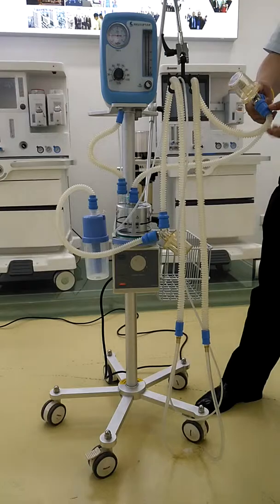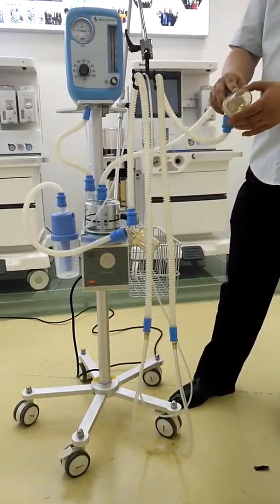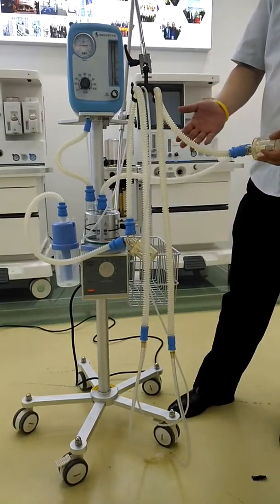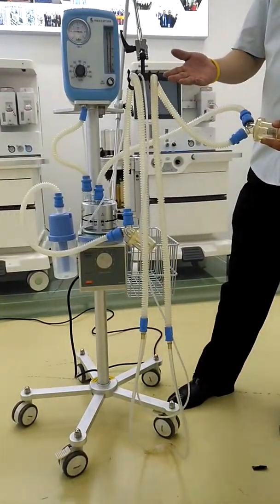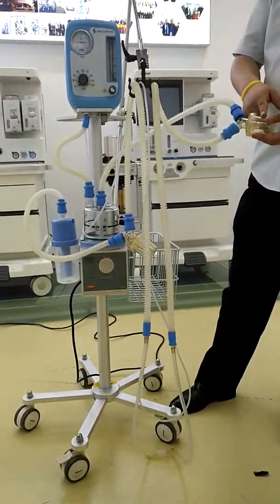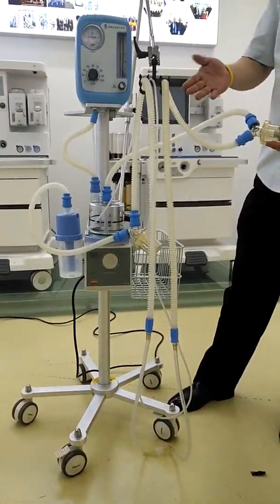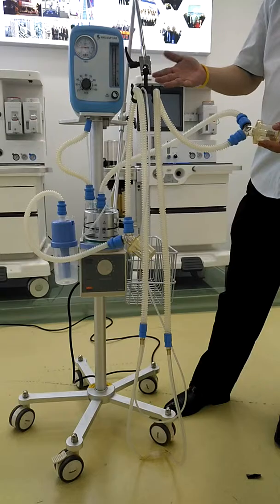Between the two pipes we're using a water trap for collecting water inside. The humidifier generates heat and wets the gas, so there will be some water inside the water trap. This prevents the water from getting into the baby's mouth or nose.